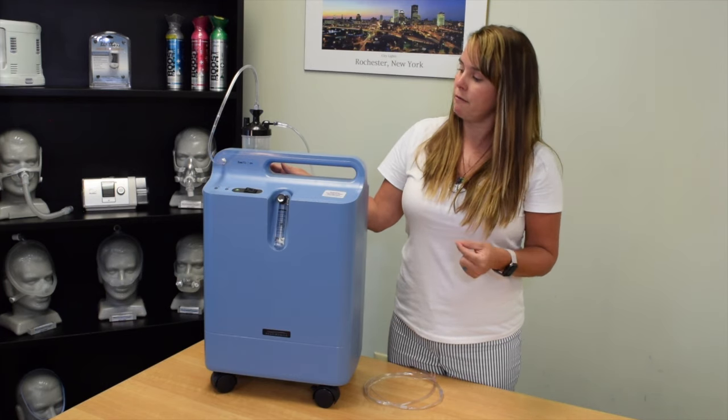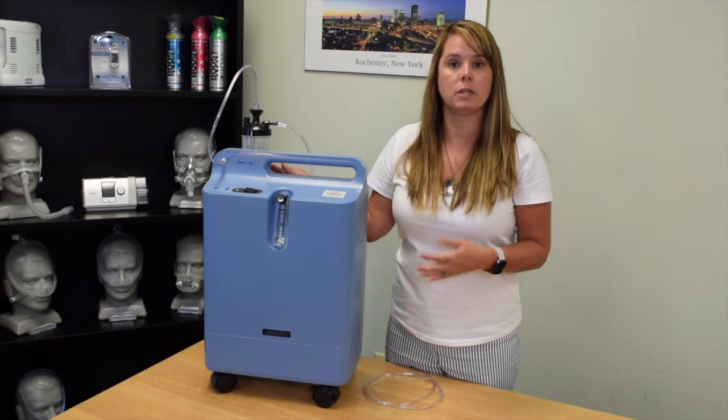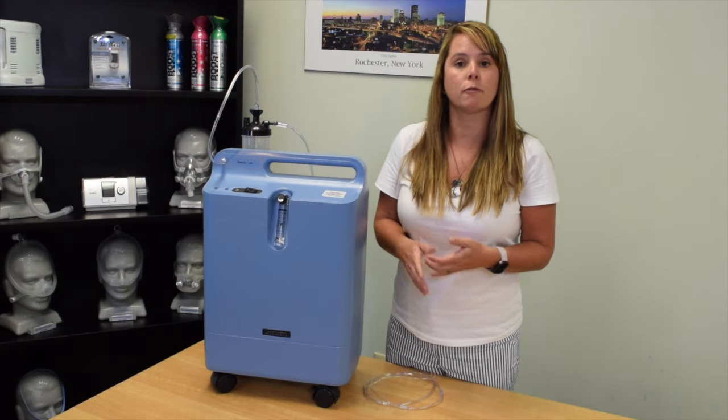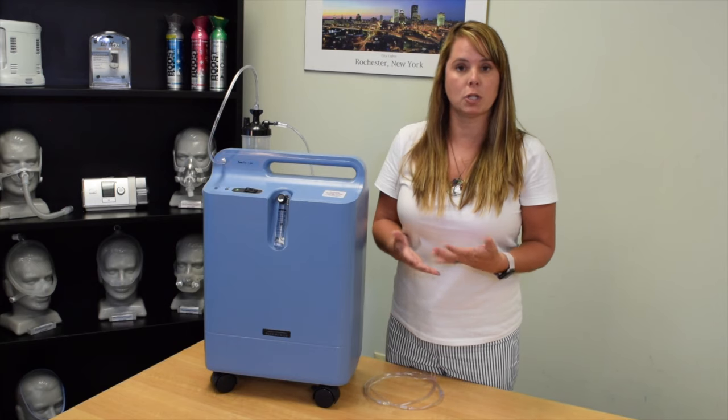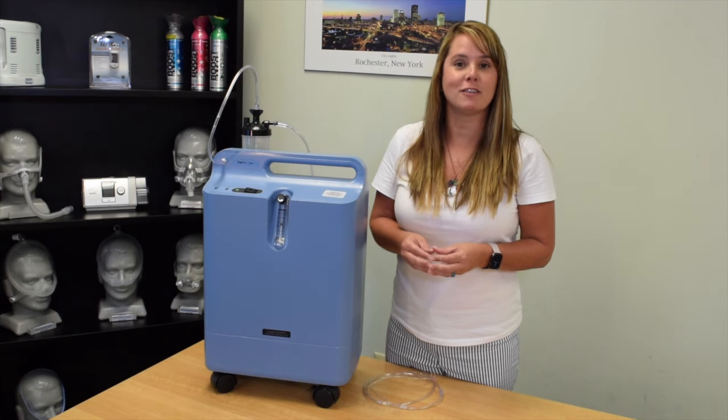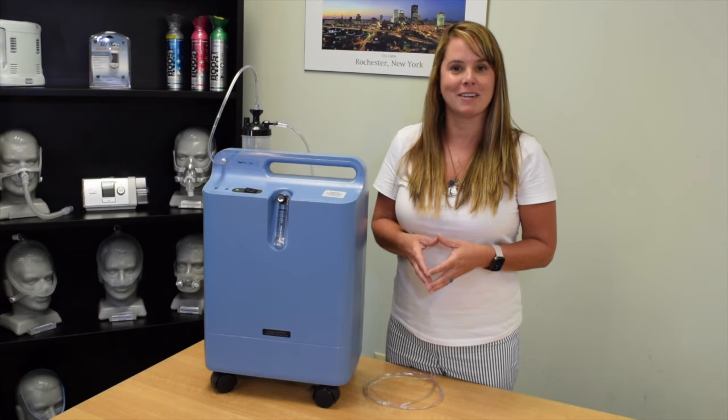If you have troubleshot the device with the alarms but cannot get the alarms to stop, it is very important for you to call your provider — give us a call so we can help figure out what is going on with your concentrator. I hope you found this video helpful, thank you very much.